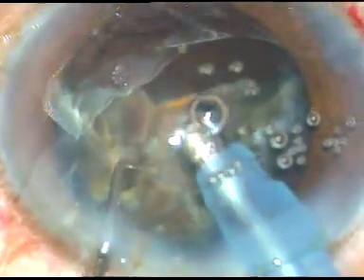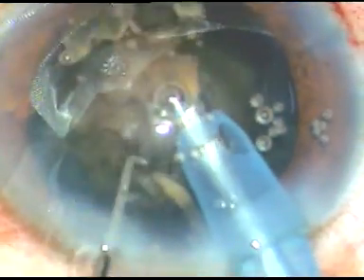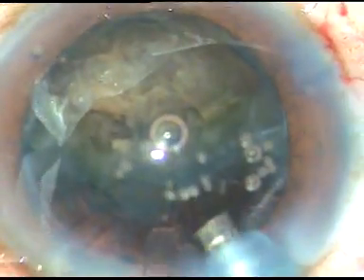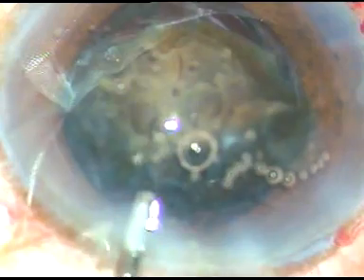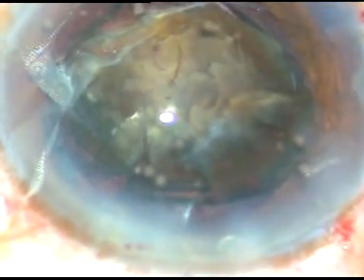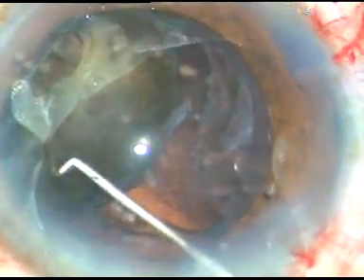So almost one hemi-nucleus is emulsified. This is a fragment, and now for this large fragment, I want to inject some more viscoelastic substance, position this fragment nicely, and then I want to emulsify this fragment. I want to rotate this fragment and bring the apex and tilt it so that I can attack from the apex.